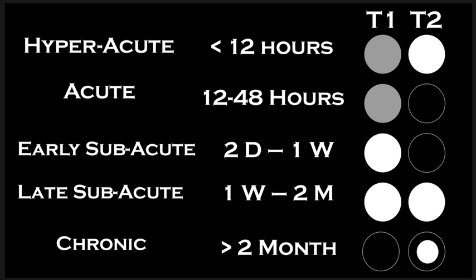And for the difference between hyperacute and acute, you can sort of go half a day, 1 day, 2 days, maybe, as one way to remember it. But regardless, you have to memorize this chart. Memorize the vocab words, memorize the times, and memorize the colors.